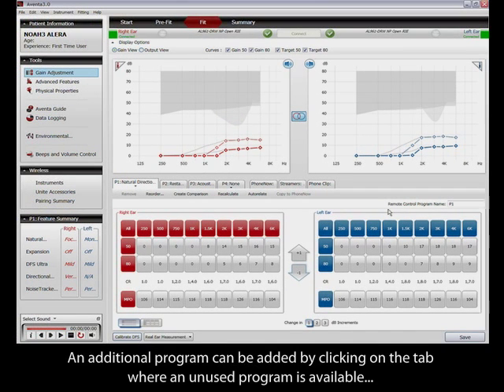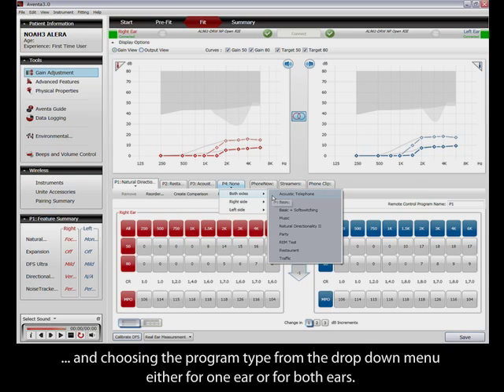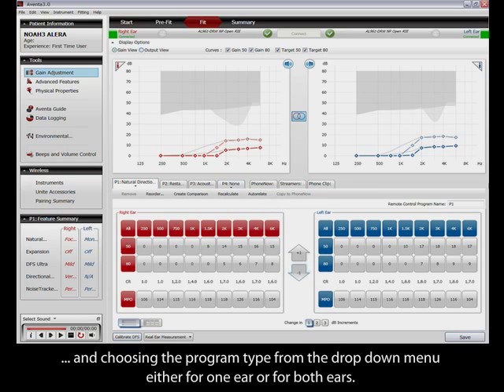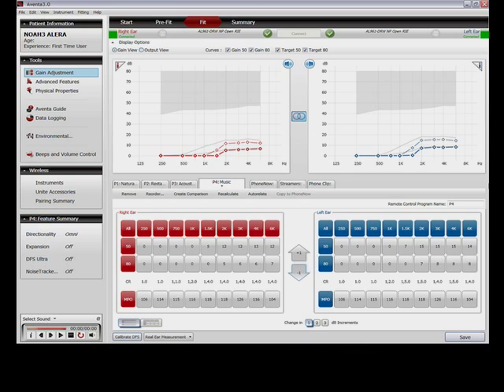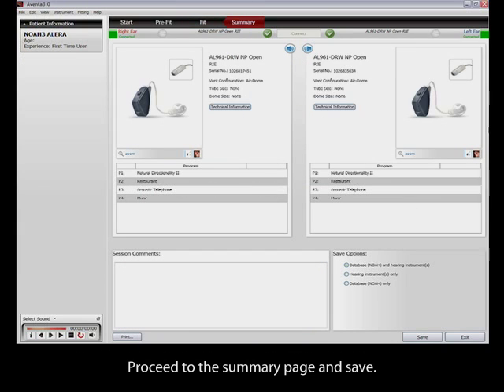An additional program can be added by clicking on the tab where an unused program is available and choosing the program type from the drop-down menu either for one ear or for both ears. Proceed to the summary page and save.